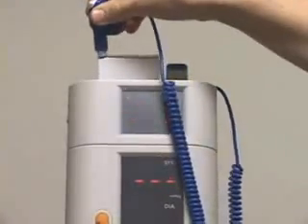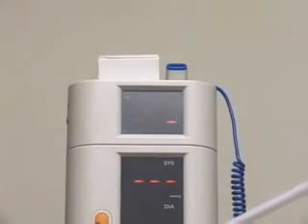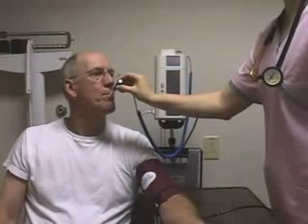To take a temperature, remove the blue temperature probe from the well and place a disposable cover on the probe. When the device beeps, it is ready for use. Place the probe under the tongue in the sublingual pocket. A traveling dash appears for 10 to 15 seconds until the reading is displayed. Discard the cover and return the probe to the well.